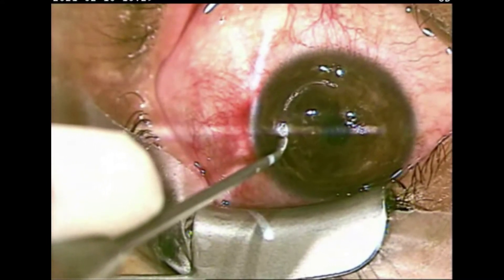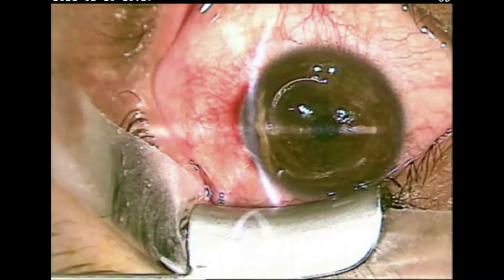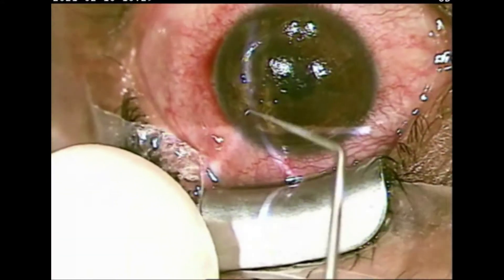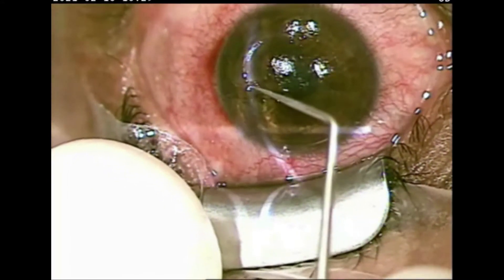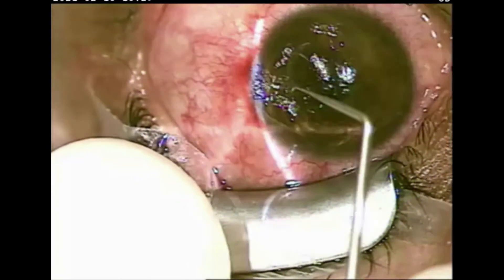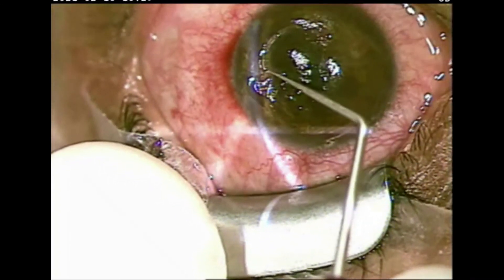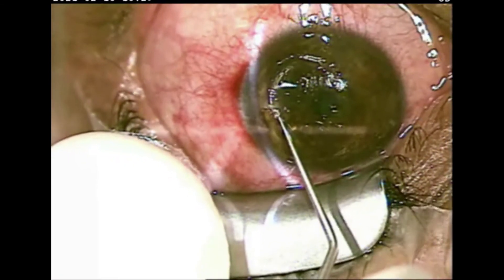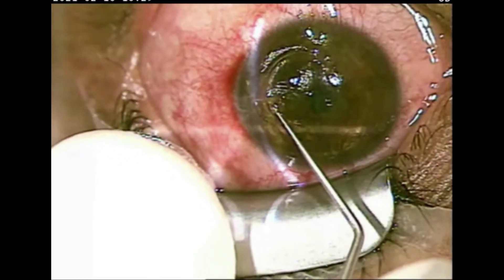The tip of the corneal ring is at the incision site, and the incision site is reopened due to the malpositioning of the corneal ring.